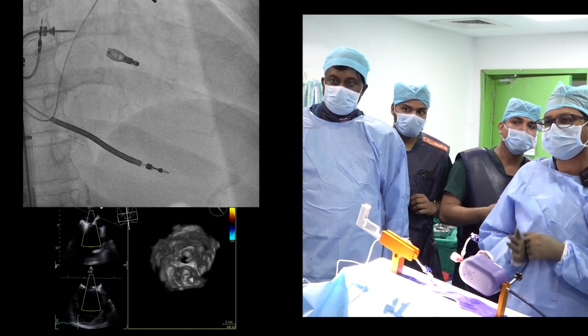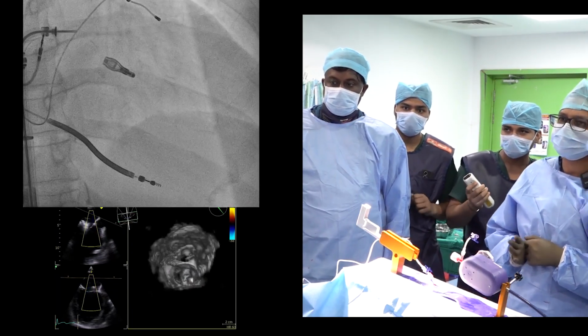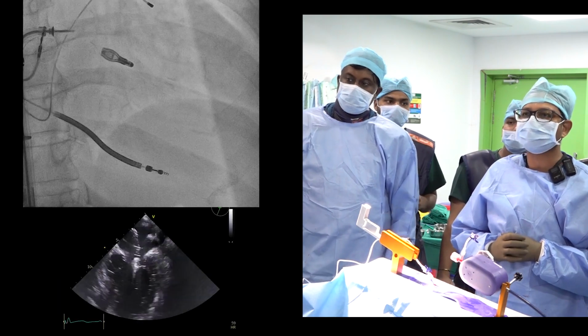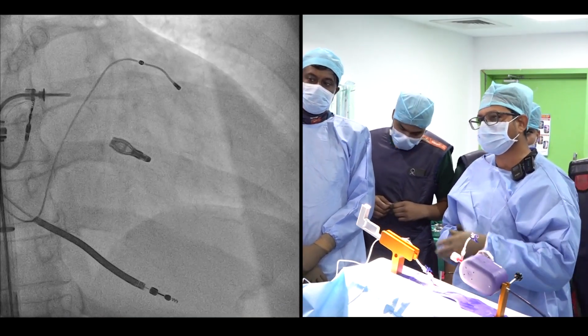So this is the final picture, and this is the 3D en face view in which we are seeing that both the leaflets are grasped by the MyClip and they are moving very well. And now it is time to release the MyClip. You can see here this is the release of the MyClip. Now we have released the MyClip.